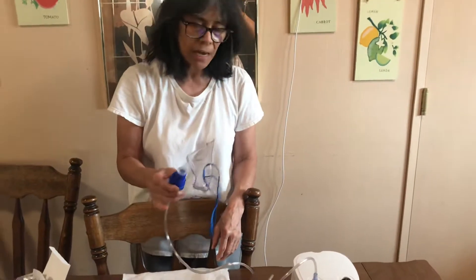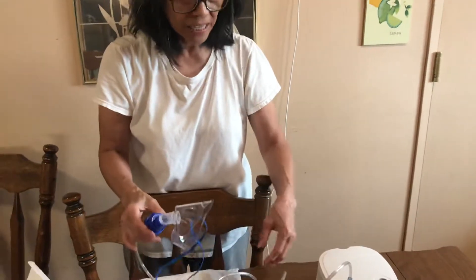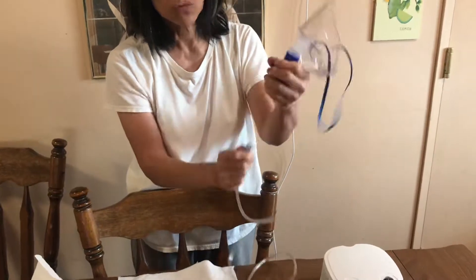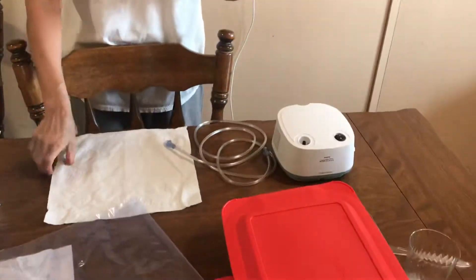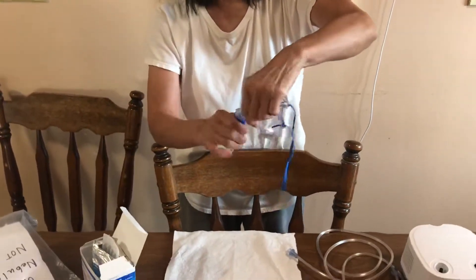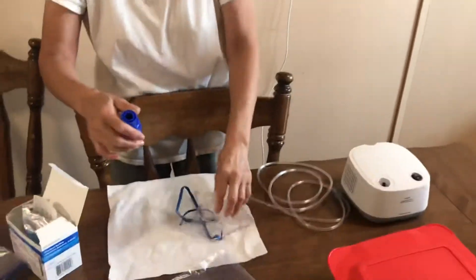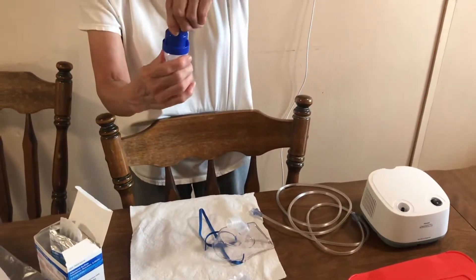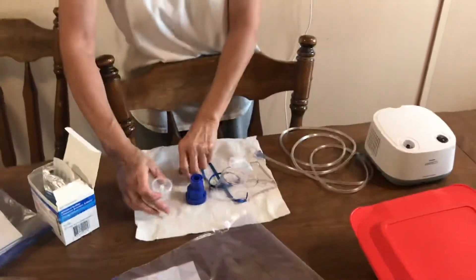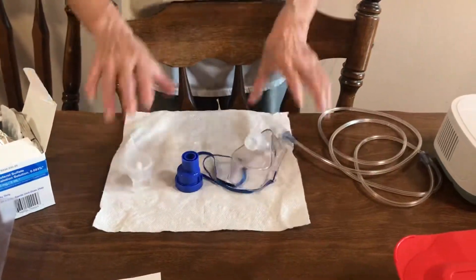After she's done, you switch it off. I take this off of her face and disconnect this. The tube I don't have to wash. But I wash the mask — with warm water and detergent soap. I take it apart into these four pieces, wash them in warm water, rinse, and then dry them.